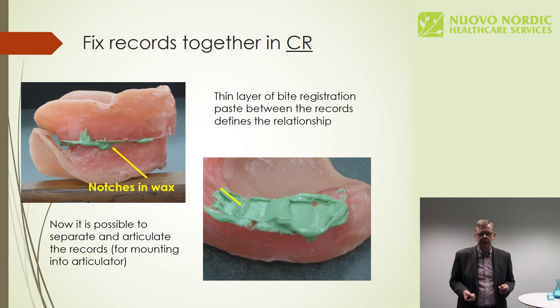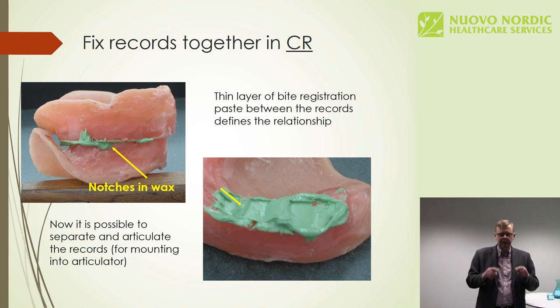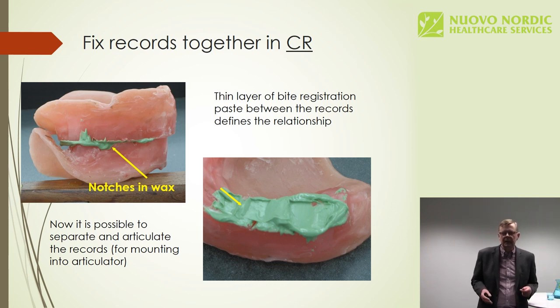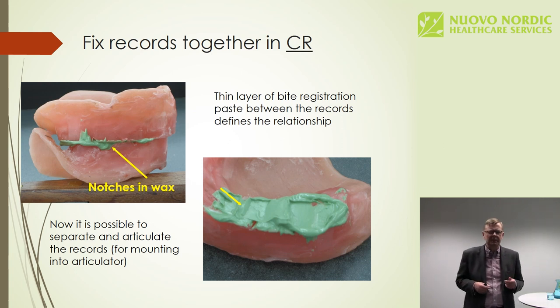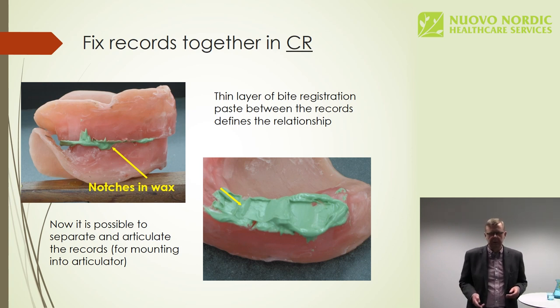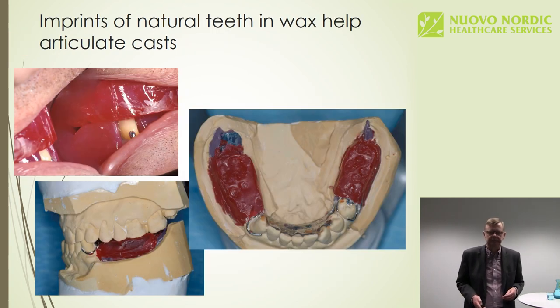However, for complete dentures, or whenever there is one complete denture in the jaw, we'll use the CR, centric relation, as the reference position. You can either melt the wax rims together, or you can, as in this picture, use a thin layer of bite registration medium. Melting the wax rims together may become a bit tricky if you are not comfortable with a hot knife. The patient may be a bit afraid of it. Anyway, this is definitely a way in which you won't burn the patient.